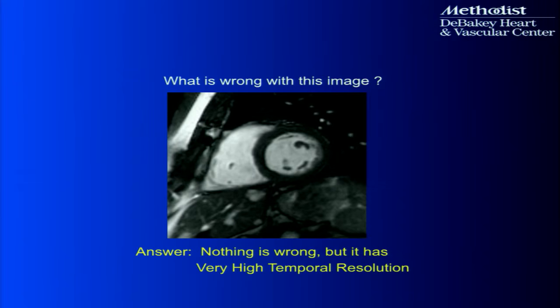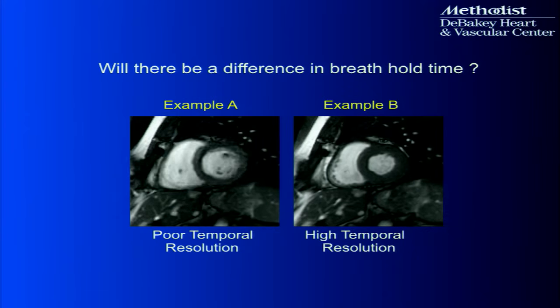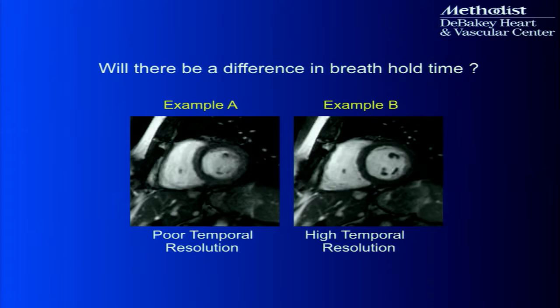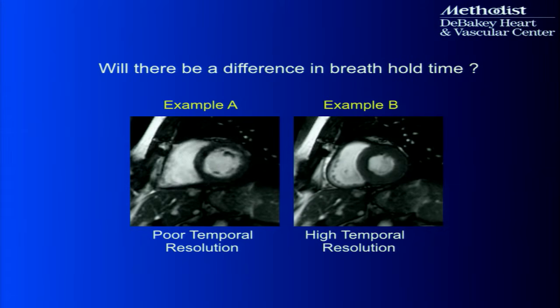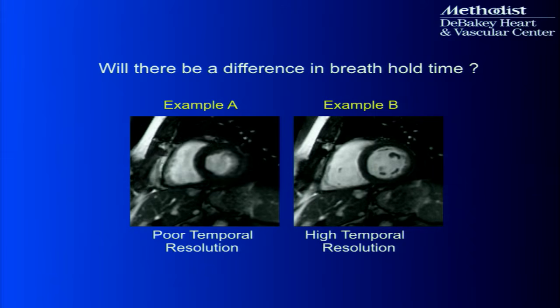Now, there's going to be some differences though, and the question is, in the left example where I had a poor frame rate of about 10 frames per second versus the right where I've got a frame rate of about 50 or 60 frames a second, what's the difference in the breath hold time?